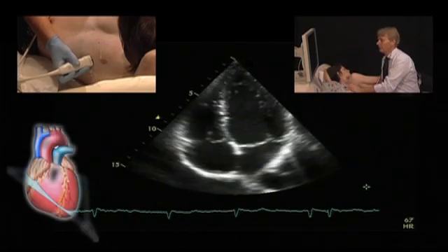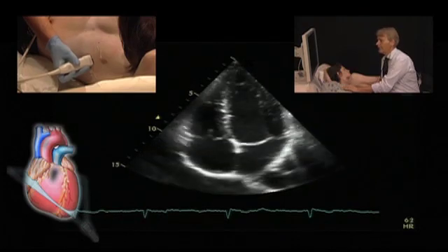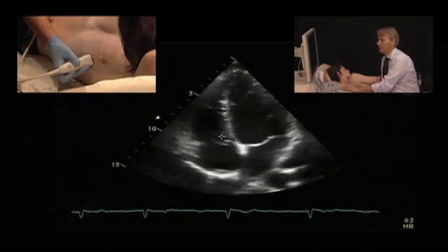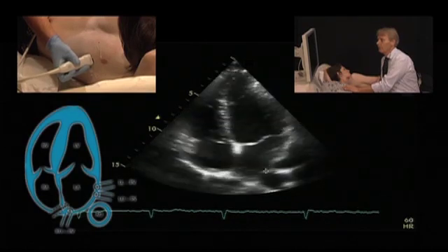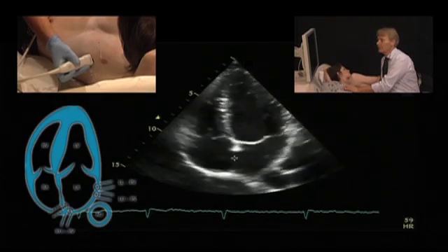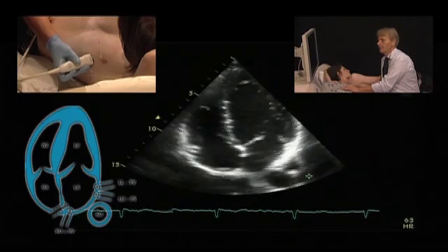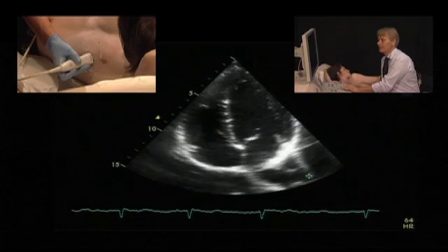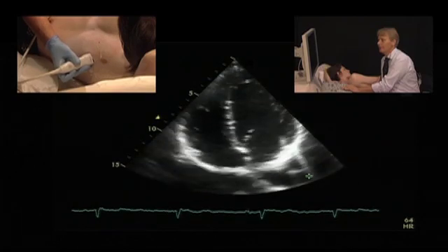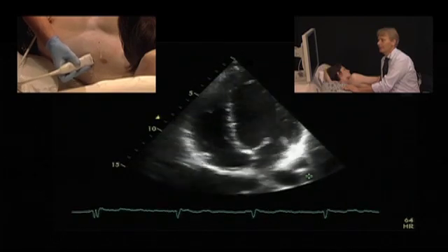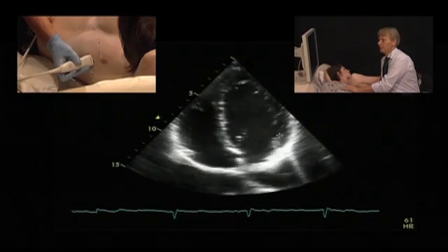The four-chamber view should be oriented in such a way that the septum is parallel to the ultrasonic beam. It is furthermore important to really check that the atria are as large as possible, because if you're angled down you don't have an optimal four-chamber view. So you have to tilt until you really get large atria, and then you can see the following structures.